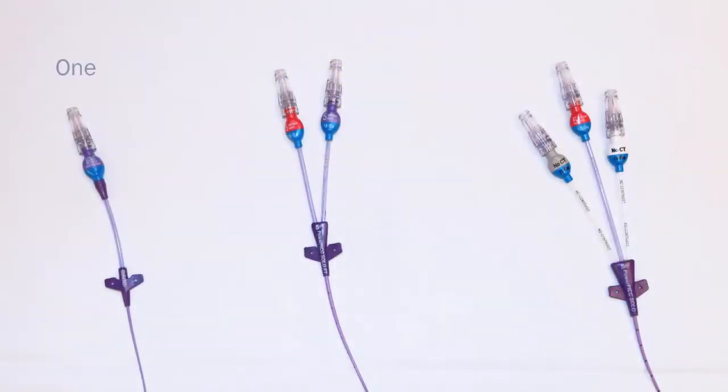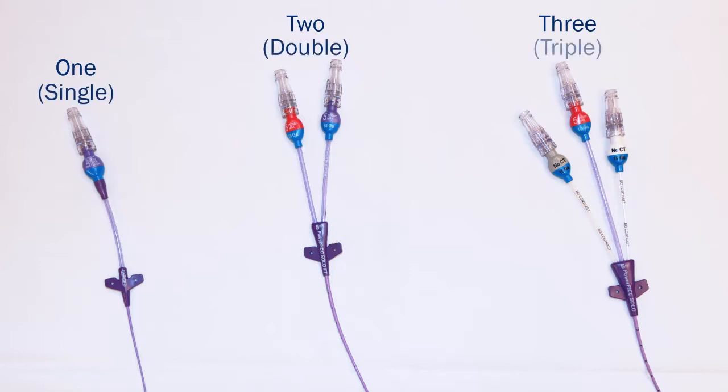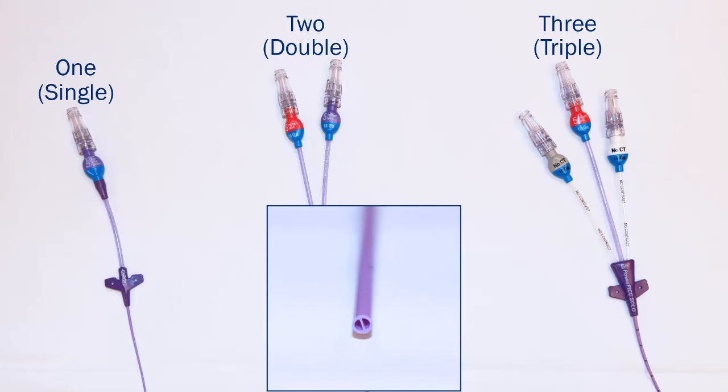The PICC may have one, two, or three openings called lumens. Depending on how many lumens your catheter has, it will be called a single, double, or triple lumen PICC. Each lumen is a separate channel and can be used to infuse different medications at the same time.